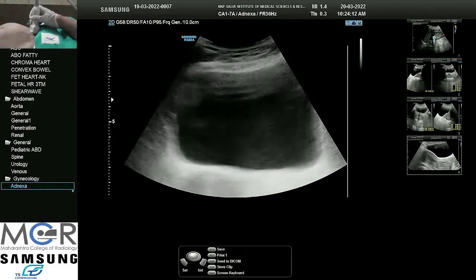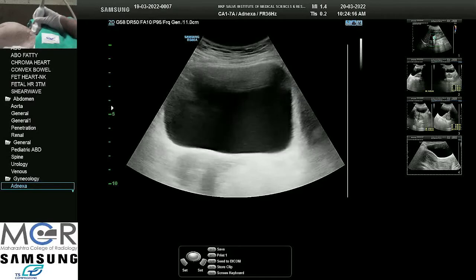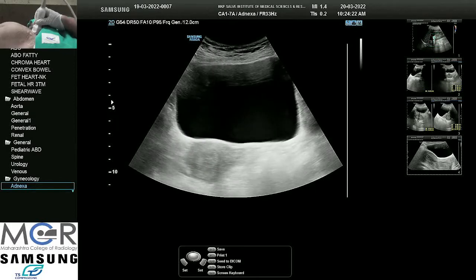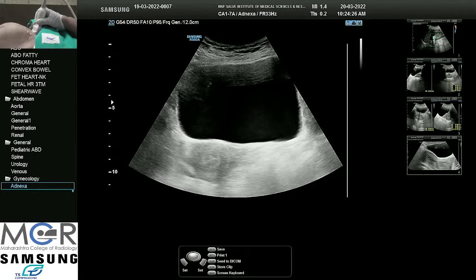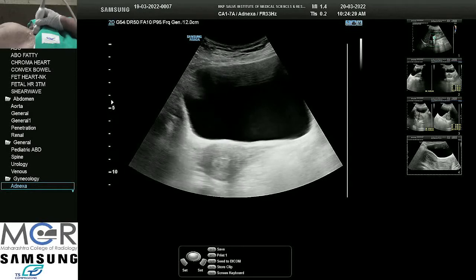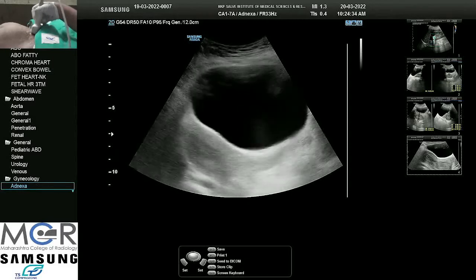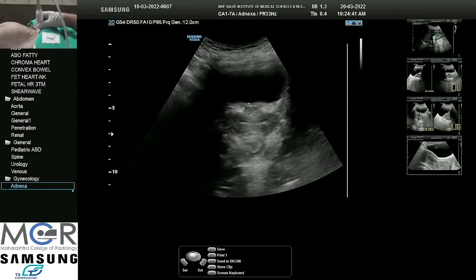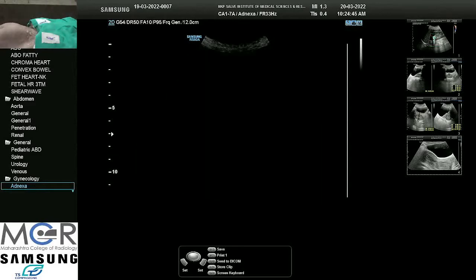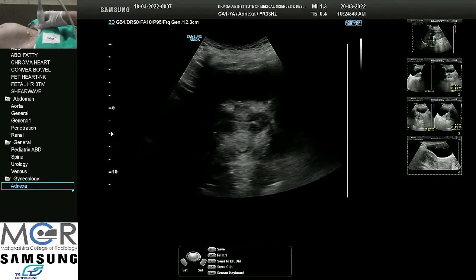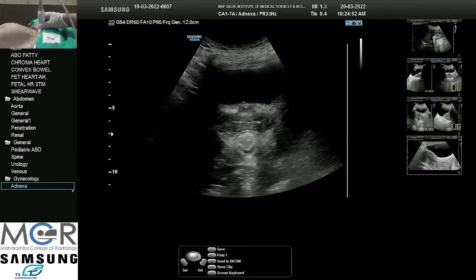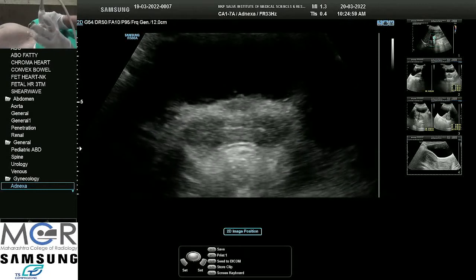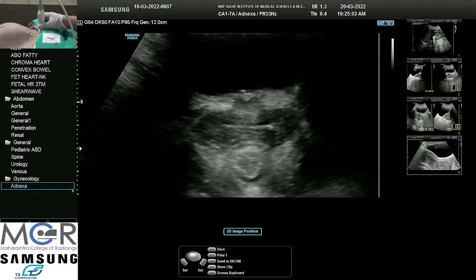The bladder should be adequately full when we start the transabdominal sonography examination. An over-distended bladder will not allow structures to be seen properly and we will get false measurements — from uterus to endometrial thickness. And if it is not distended properly, visualization may not be good either. When we start the examination, we place the probe on the pubic symphysis and try to bring the area of interest to the center. The angle should be appropriate because if it is too broad, the clarity of image is not there.